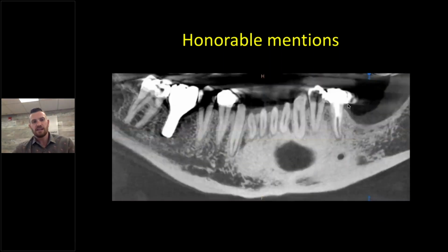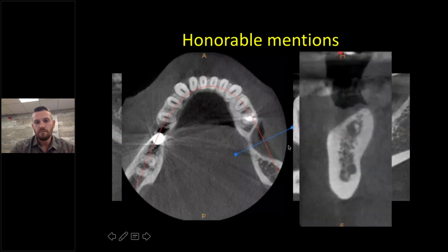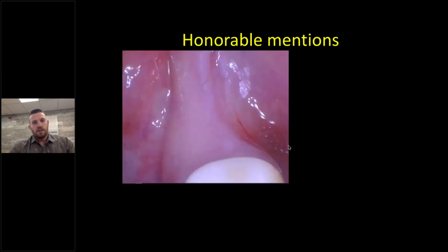And so this first case is a case that we were doing vertical and horizontal guided bone regeneration. The patient desired an implant, site number 19. And as you can tell, there is a significant amount of vertical bone loss and horizontal as well, which you'll see in some of the photos. You can also tell on just a view of the CBCT here that the bone plate is quite devoid. And this is a cross-sectional image. The implant height, the platform would be off, and there's not enough bony support to buffer biological health of that actual implant.